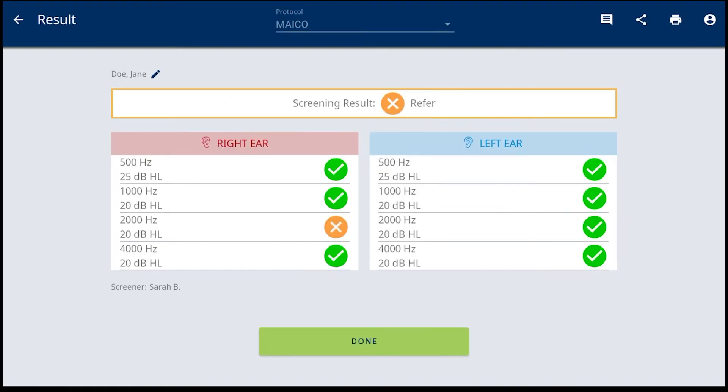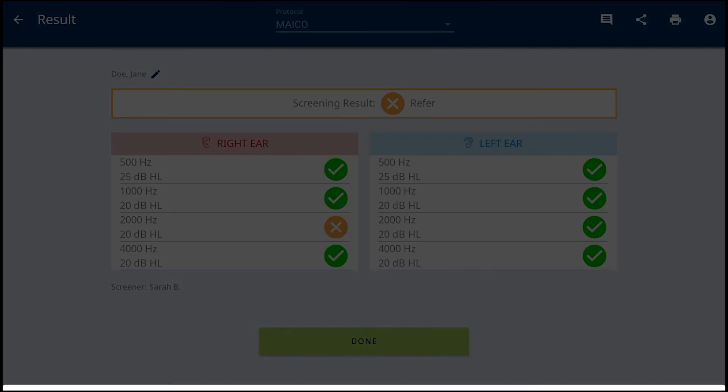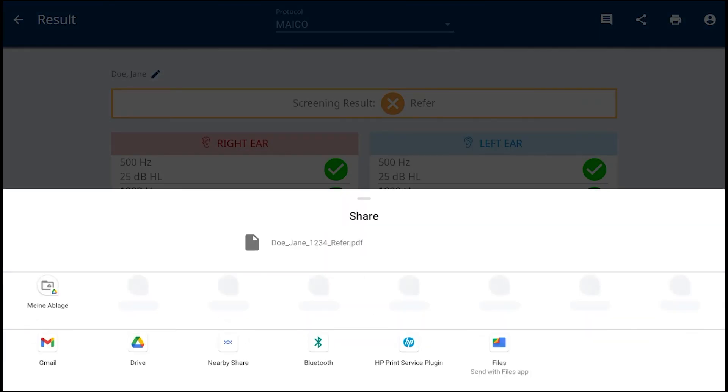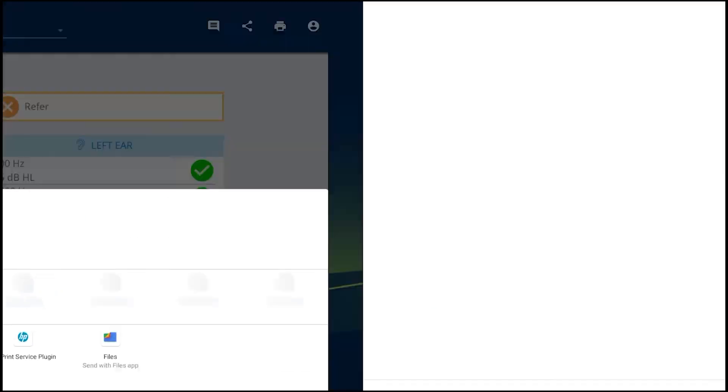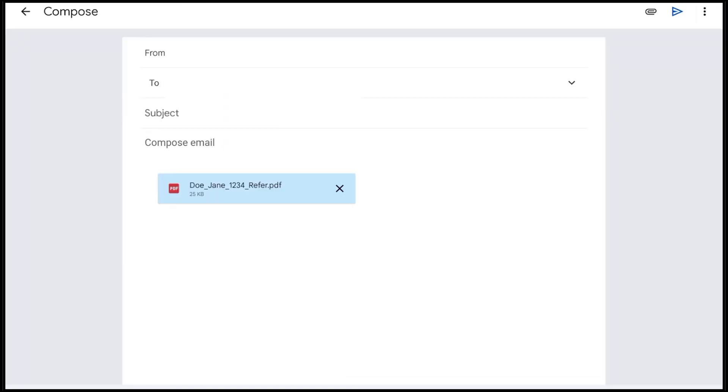There are sharing and printing options to manage the screening result. The share icon allows quickly sharing or saving of a PDF printout through any Android apps that are installed on the tablet. Email, Dropbox, or saving to a Google Drive are some examples.